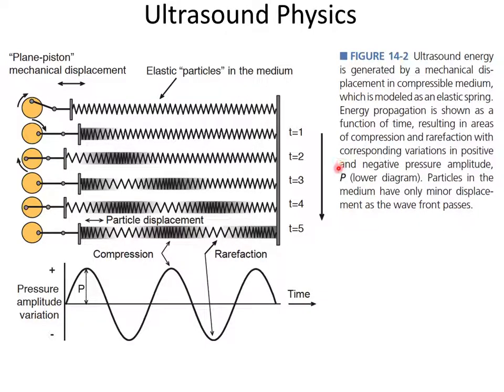So the basic principle by which these signals are created is longitudinal or compression waves of sound. If I put a transducer element, which in this cartoon is represented by this surface right here, and I push it back and forth in this direction when it is sitting up against a material, which is this spring right here. So this is the body.